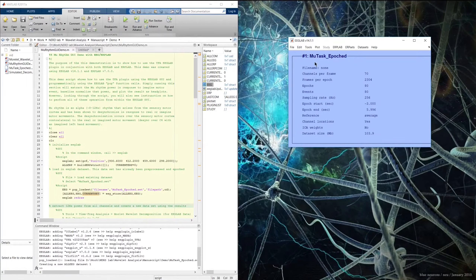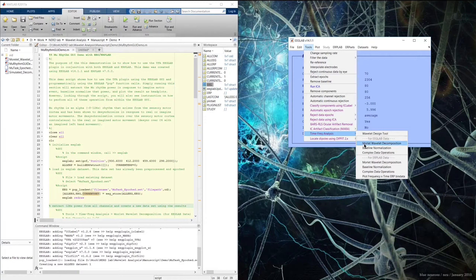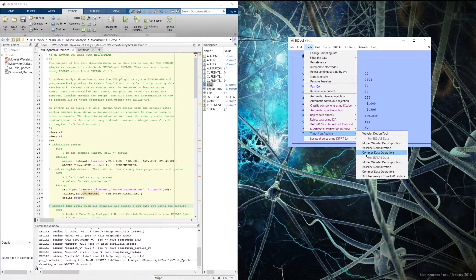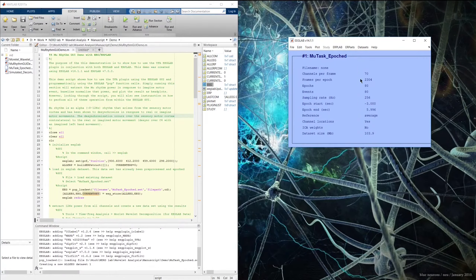I've created a time frequency analysis package that is a plug-in for EEGLAB, and it makes the Morlet Wavelet decomposition function compatible with both EEGLAB data and ERPLAB data sets. This package is very useful when using EEGLAB either programmatically in script or within the GUI environment.